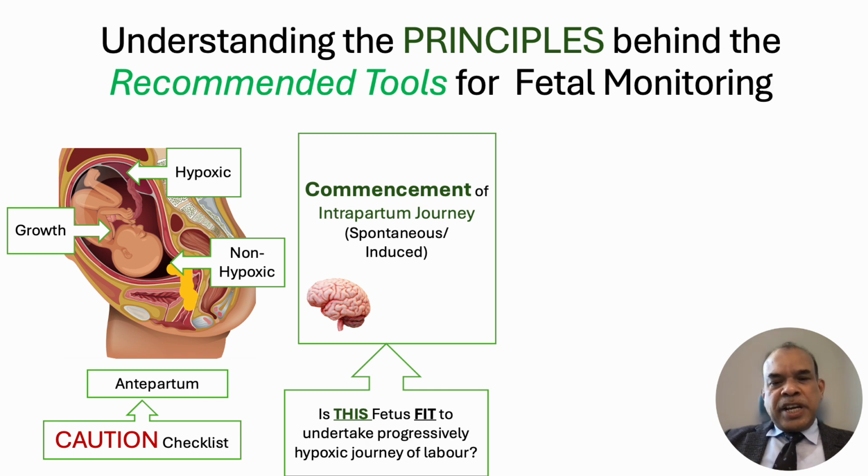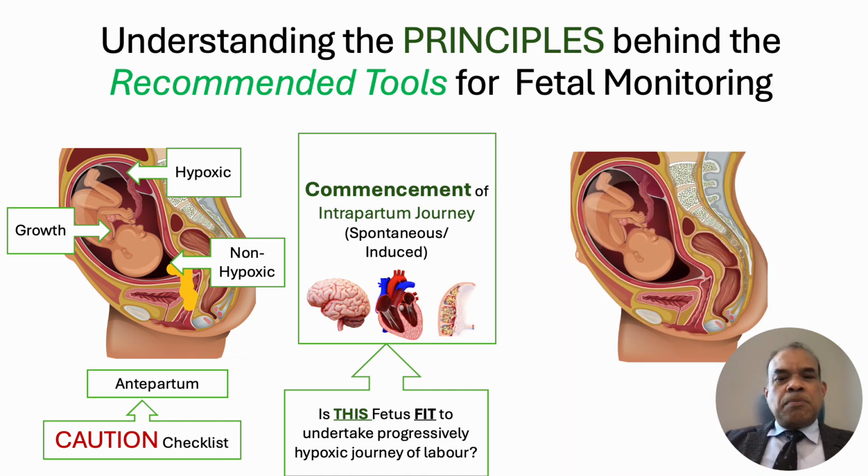But that is by checking the functions of three organs: the brain, the heart, and the placenta. And this is the fetal monitoring checklist we'll be looking at.